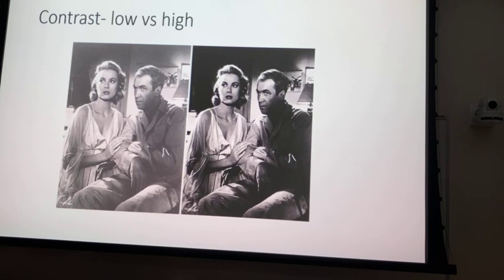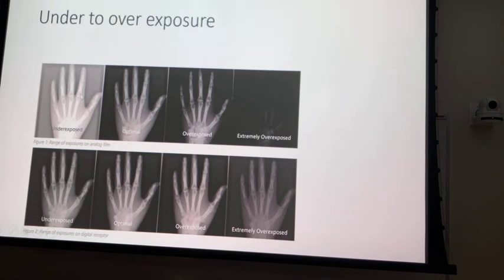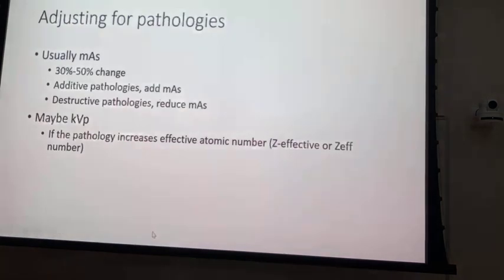This looks a little washed out, this looks a little bit too high, both of them are really not that bad as images, but going back to the one we saw before, just ugly on both ends. And these down here are much closer together, but look how low a contrast this is compared to that more gray. Can you kind of see that? It's more gray. The soft tissue and the bone are more similar in appearance than what they are over here.